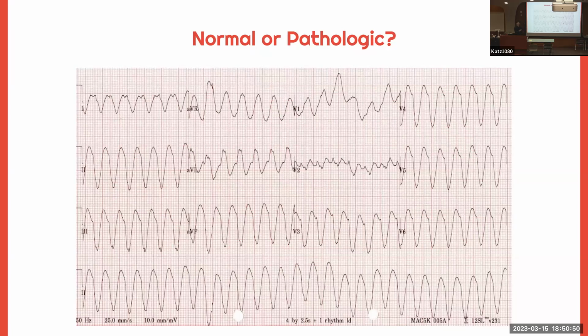Oh, somebody in the chat does ECGs. Yeah, this one's not good. There's no structure, just waving all over the place. And as chat correctly says, this is ventricular tachycardia. What this means is the bottom of your heart, the big pumps of your heart, are just going crazy. They don't know what they're doing. Not good, obviously. They're what's responsible for getting blood around to the rest of the body.